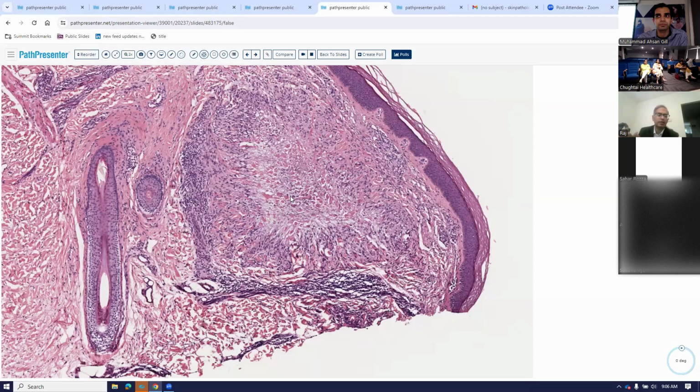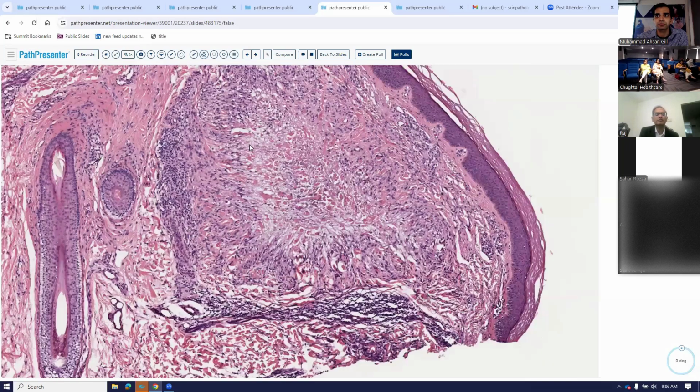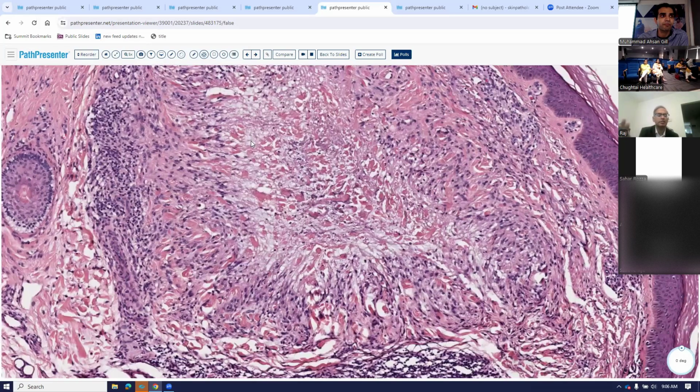Necrosis is completely dead, and on the other extreme is the normal collagen bundle. So something in between is termed necrobiosis. Within this palisade that is composed of macrophages and lymphocytes, you see necrobiotic collagen bundles. And then you can also see that there is a bluish tinge here. So that is increased mucin.